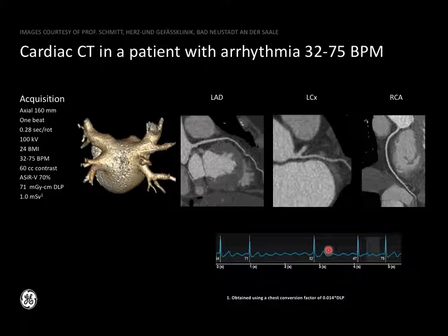In most of magnetic resonance imaging, for example, you assume each heartbeat's the same. Recall in SPECT and PET, all of those assumed each heartbeat was the same. And echo 3D assumes each heartbeat's the same for about 6 beats. However, for 2D echo, it was all real time, so you didn't really care.